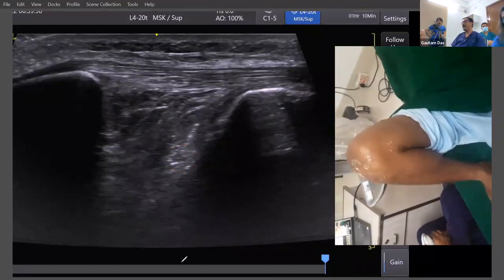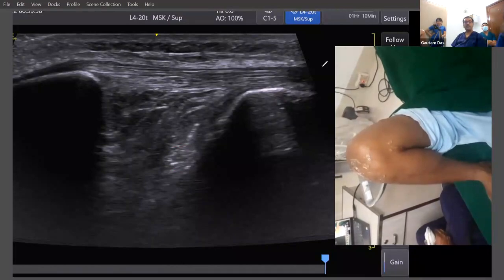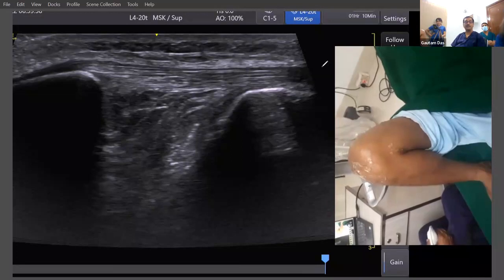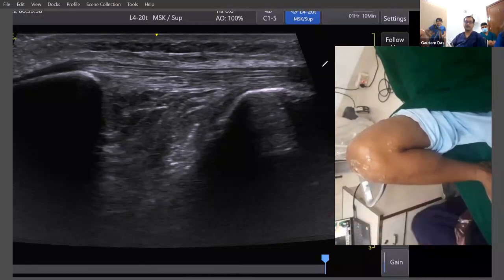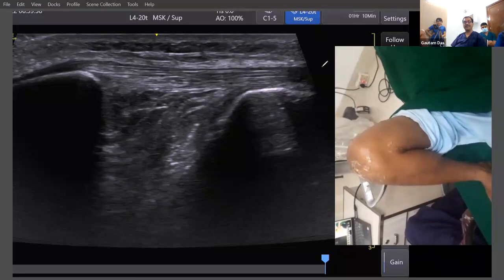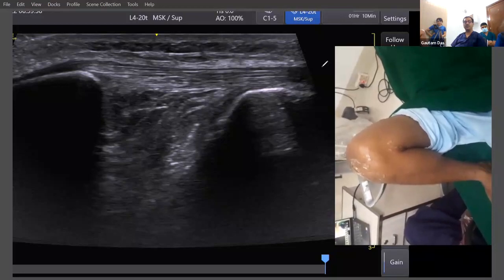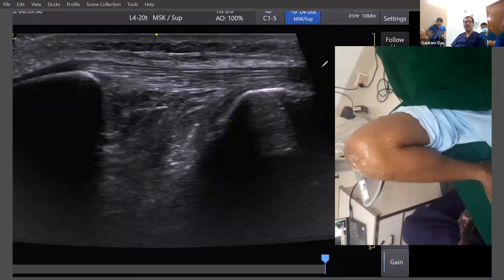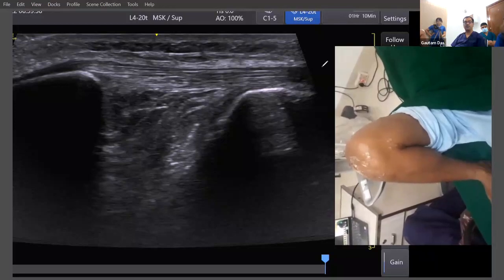Don't confuse it with the superficial layer of the Hoffa's fat pad, because the upper part looks almost similar and it is very confusing to determine which one is the ACL. The other tip is to measure the depth from the skin — it should be approximately two centimeters, or a little less than two centimeters, from where it originates.